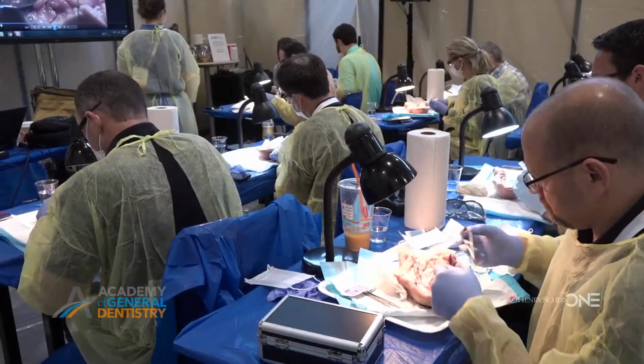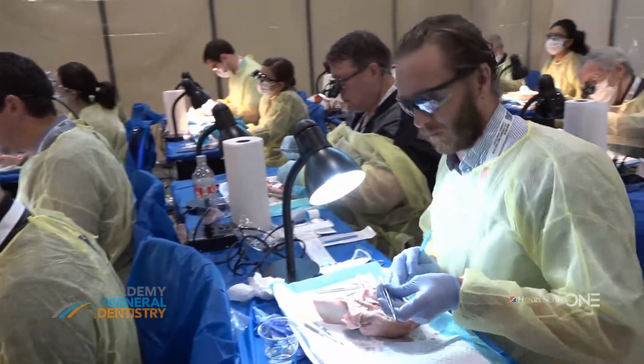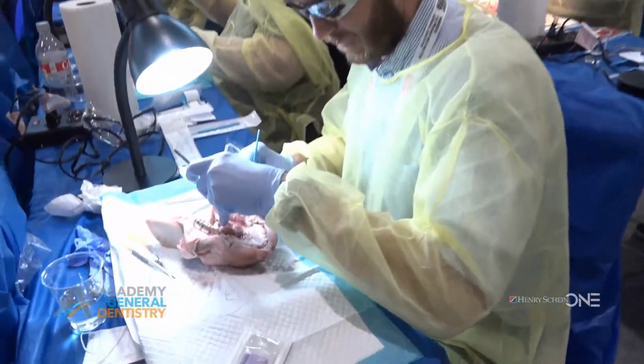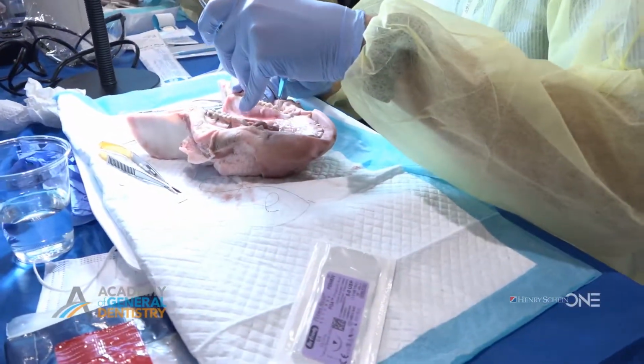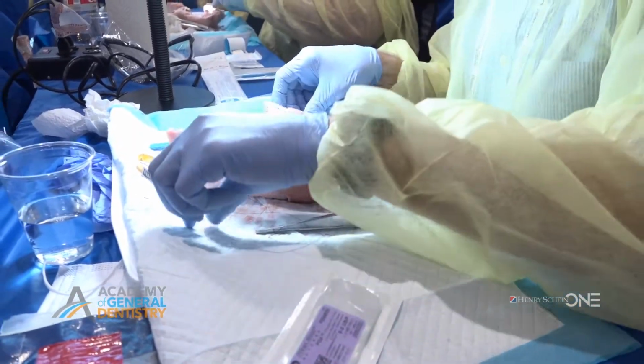I'm very excited to be here with the Academy of General Dentistry's annual meeting. The program today is called Incisions and Suturing. What we're attempting to do is give the participants a basic understanding of how to make incisions to gain access to problems around the natural dentition, as well as edentulous areas. So they're learning how to make incisions, preserve the blood supply when they do it, elevate flaps, gain access, and solve problems that happen every day in dental practices.